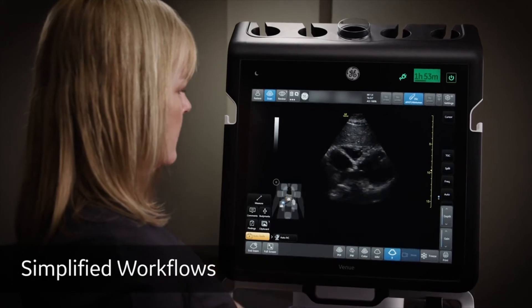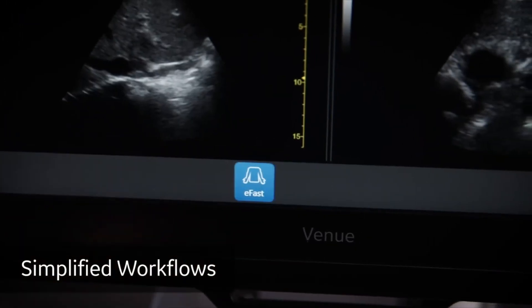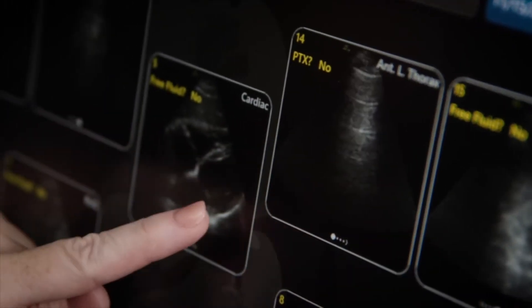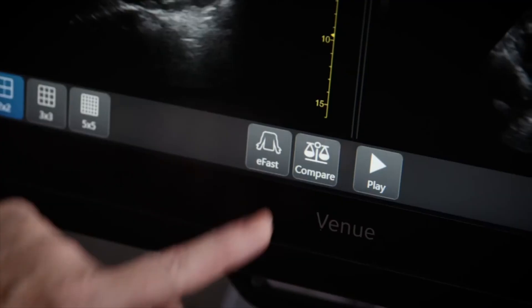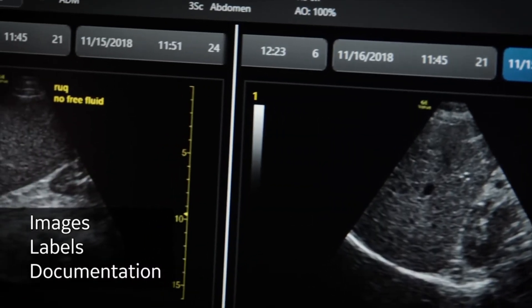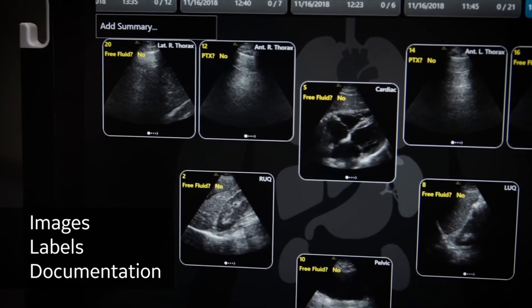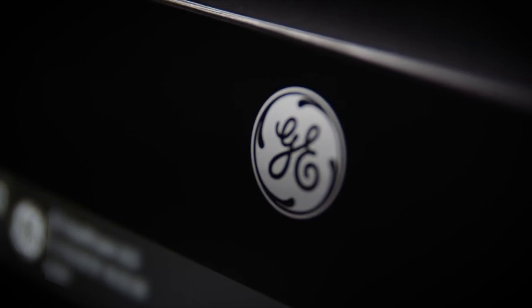With simplified workflows, you save time and have all the documentation your facility needs for accurate billing, with images, labels, and documentation clearly laid out in one place. Discover how the Venue ultrasound system helps you focus on the job you were trained for — excellent patient care.